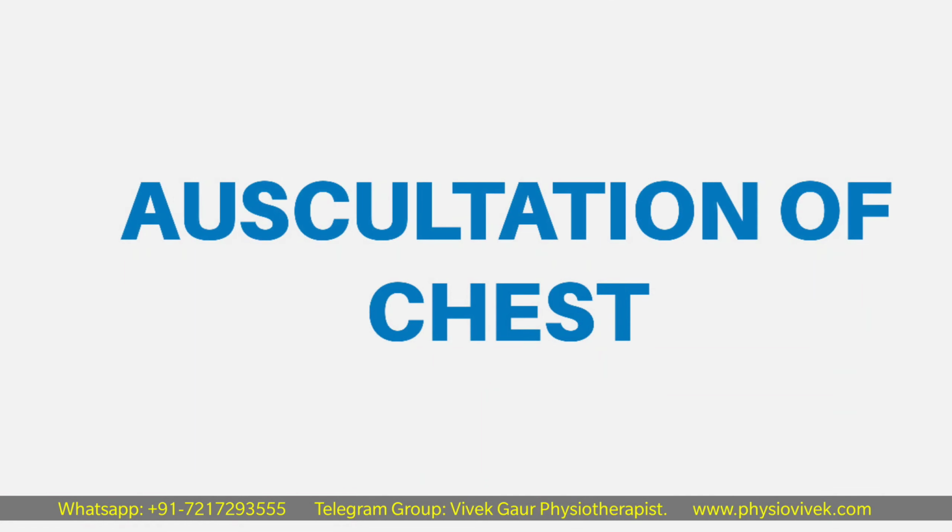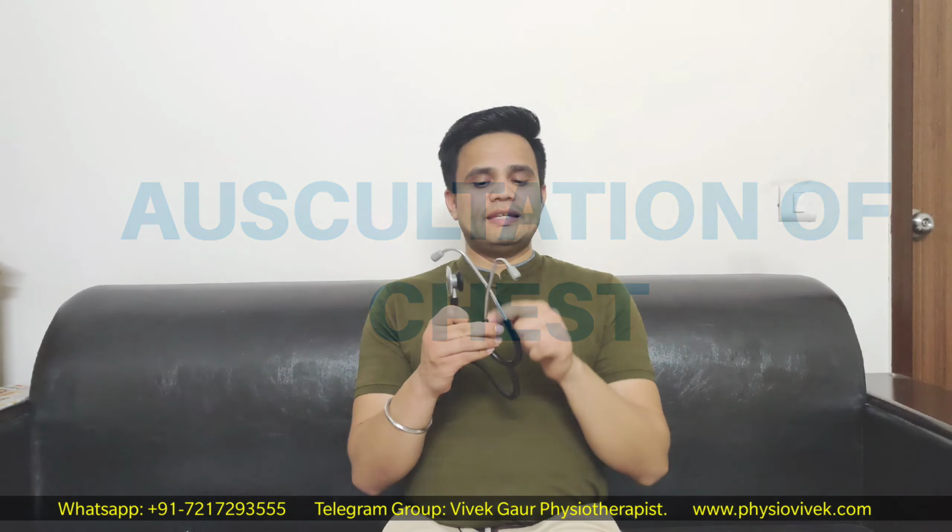Alright, so we come to the auscultation part. You can see this is a stethoscope which has the ear part, tube, and over here you can see there is a diaphragm and a bell. So you can see the diaphragm is the larger ring, and this is used for listening to high pitched sounds. For example, S1 and S2 heart sounds. Over here is the bell, which is actually used to listen to low pitched sounds like rumbling, murmurs and rubs.